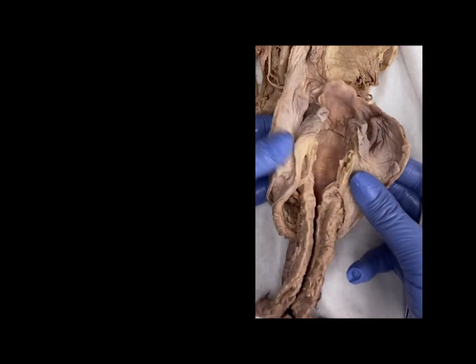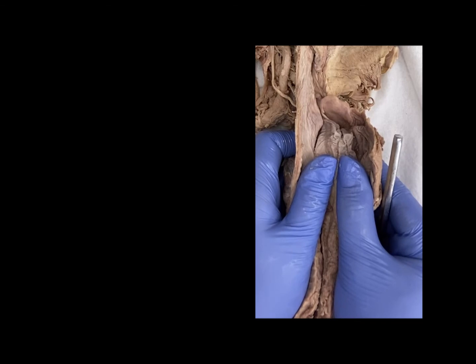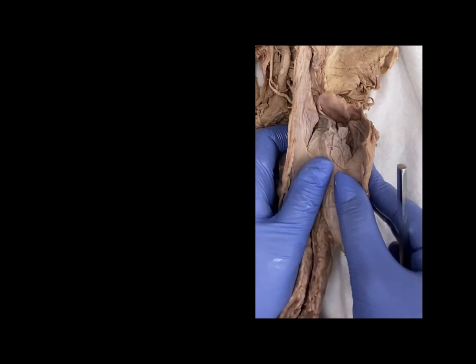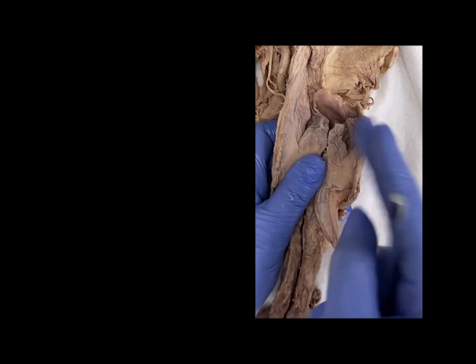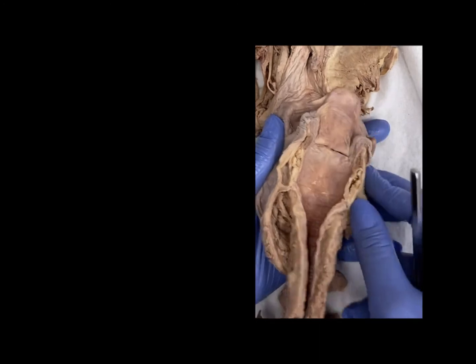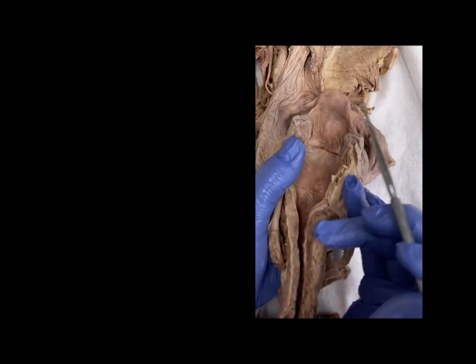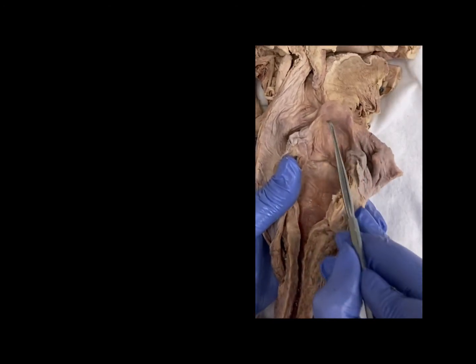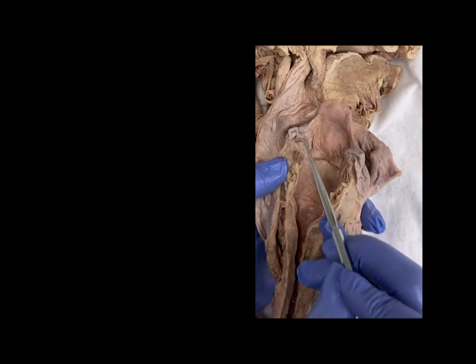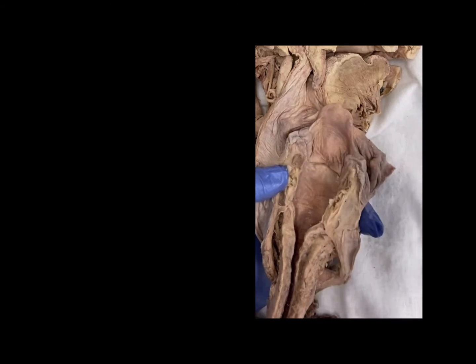So if we open it up, remember that the only cartilage that's going to go all the way around is that cricoid cartilage. So when you're opening a larynx from the back to let it fix, you're actually cutting through that cricoid cartilage. Here, that's exactly what we've done. We cut through the cricoid cartilage here and here, and then we've opened it up to see, wow, this is so beautiful. Epiglottis, aryepiglottic fold, the arytenoid cartilage is in here, covered by all that mucosa. So I can feel it, but you can't really see it.